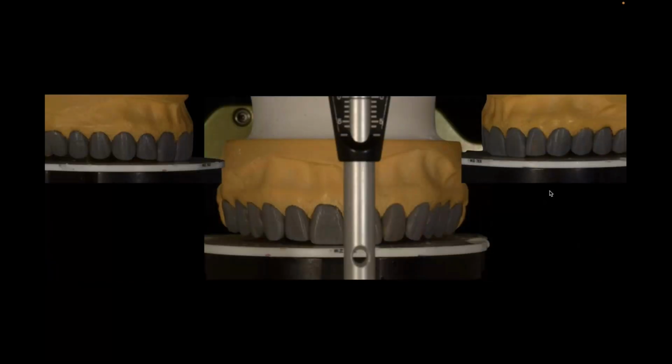Another advantage it gives me is I can understand where to put the teeth. So as an example, for Ella's case, I knew I wanted to make the teeth 2 millimeters longer in the anterior. So what did I do? I took the table that's set to a horizontal, I dropped it down 2 millimeters, and then I waxed my teeth to it. I should say Jen waxed the teeth to it, because Jen does a majority of all the waxing in here these days. And I'm sure if she saw that wax up now, 8 years later, she'd say, oh, I could do it so much better, right? That's the way we're always looking at what we're doing and trying to change and grow in the end.